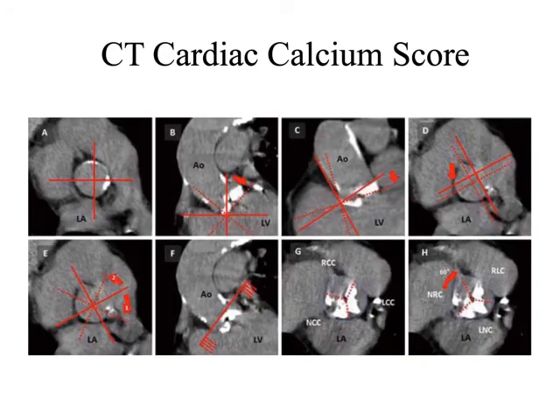All right, and this is what these pictures look like. The machine will actually take the data and feed it into a computer program that will then gauge how much calcium is in the various arteries of the heart, and it will give you a series of numbers. So it will report really accurately what the risks are, and it's going to be looking at the different valves and cusps and arteries in the heart.